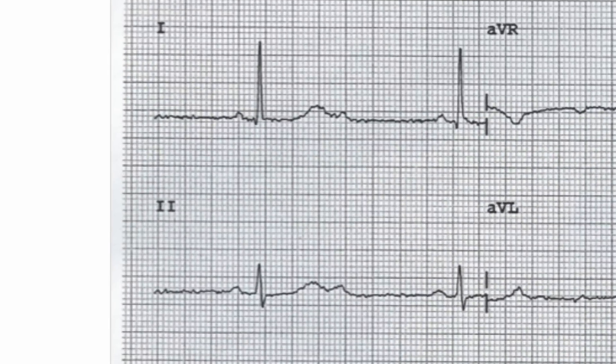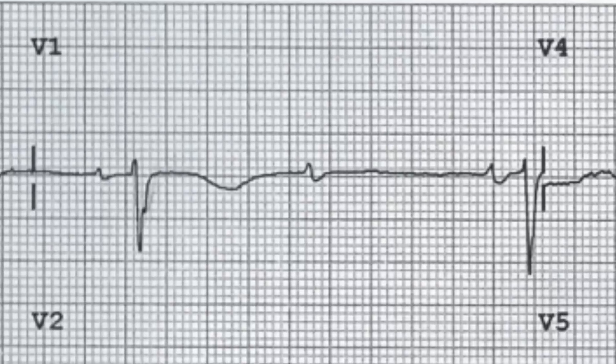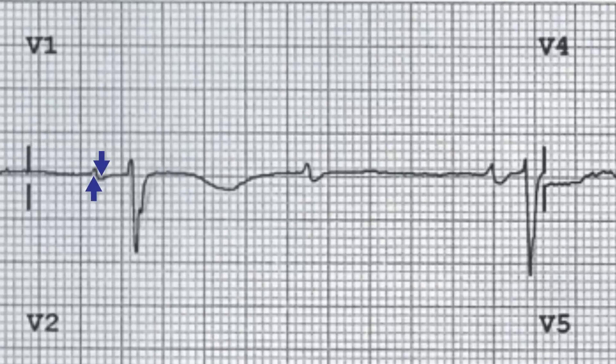The axis is normal with an up-going complex in lead 1 and 2. The P wave morphology is biphasic in lead V1, which is subtly atypical and may indicate that the P wave activity is coming from somewhere other than the sinoatrial node. When the P waves are conducted, the PR interval is less than 5 small squares and is therefore normal.